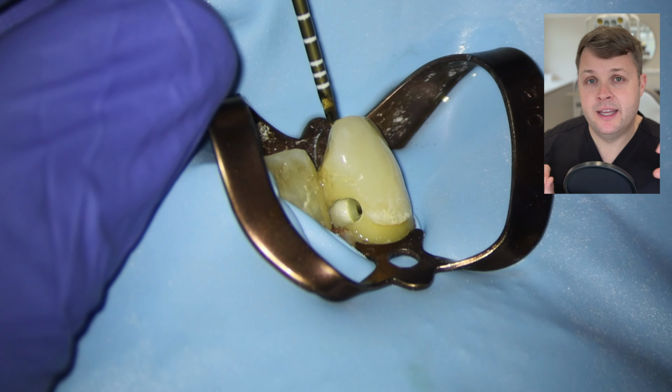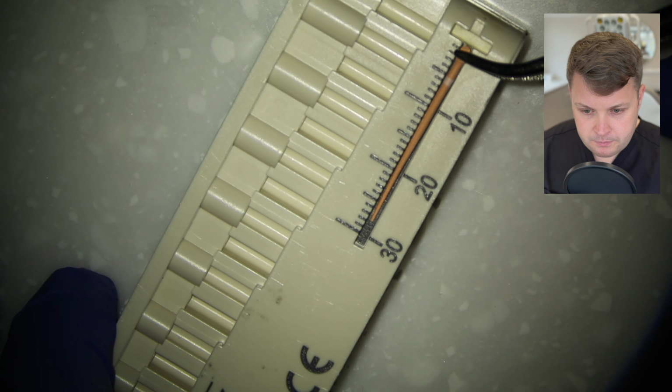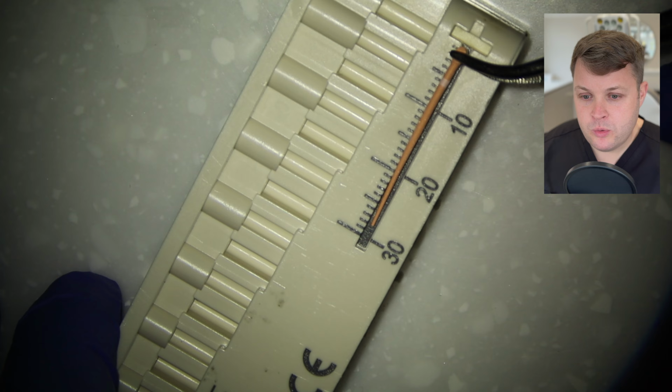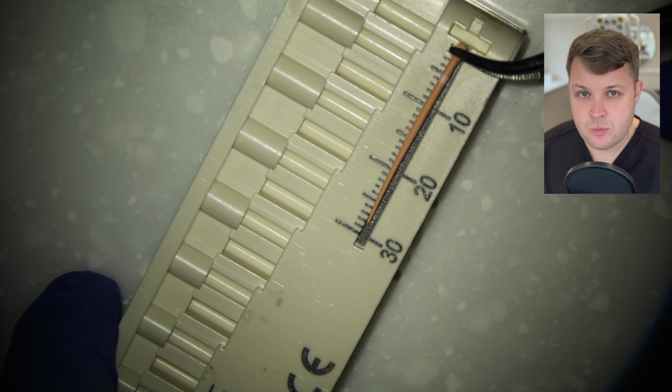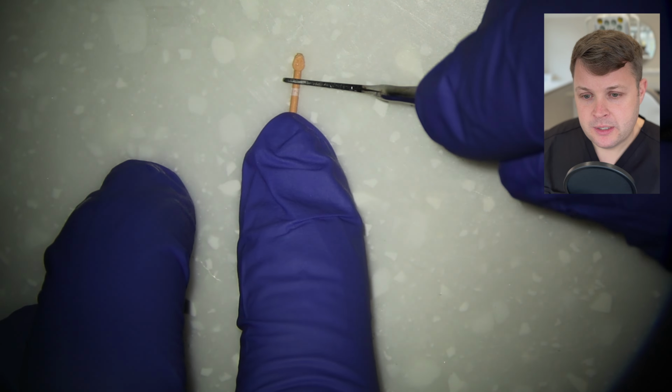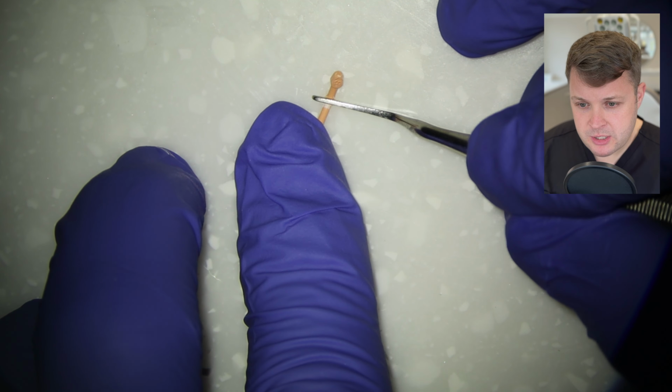But in this case, I want to show you a different way of managing an extra long canal, and this is by splicing the GP cones together. So what we notice here is if we just take a conventional matched cone, it only reaches to 27, 28, which is not long enough for our GP cone to reach length. So what I do is I'm going to get 2 cones.